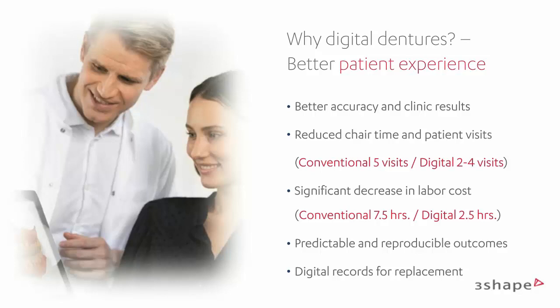There's also a dramatic decrease in labor cost or labor time. So you go from 7.5 hours to 2.5 hours for digital. So there are such strong benefits on this. And on top of this, there are predictable, reproducible outcomes. You have a digital record. I had a good friend I just met here whose mom got a denture. And of course, very classic, 2 weeks later, the dog ate it, and he had to do it all over again. But this is a real story. I don't know what dogs have with dentures, but I think we all have heard these stories.